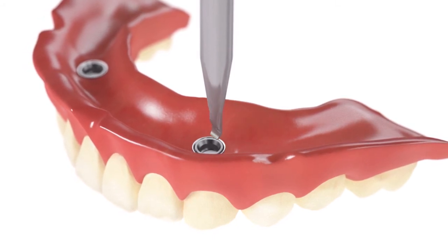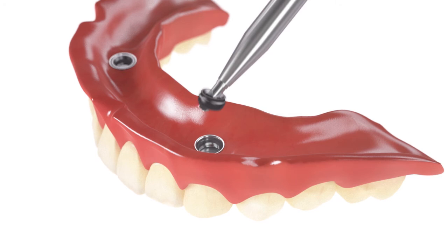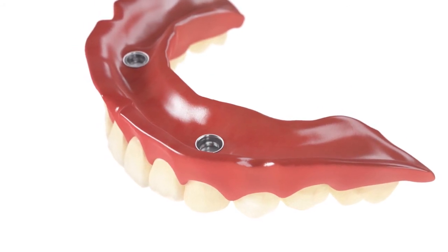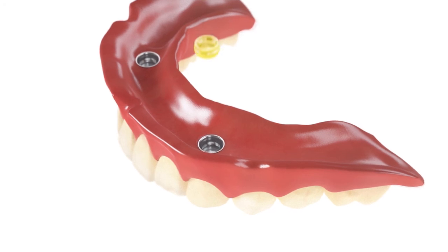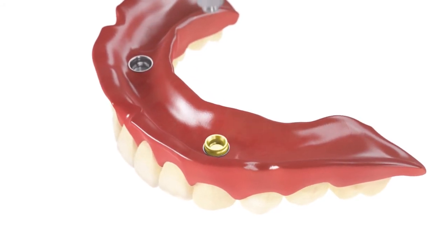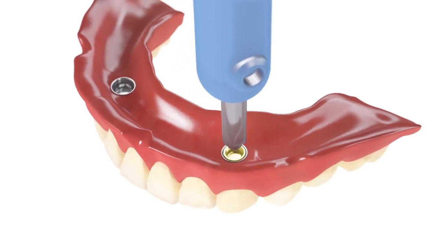Remove the black lab inserts using the OD Secure extractor tool. Choose the desired retention strength. Insert the retention cap into the housing using the OD Secure insert tool.